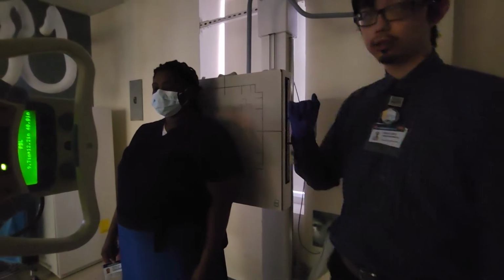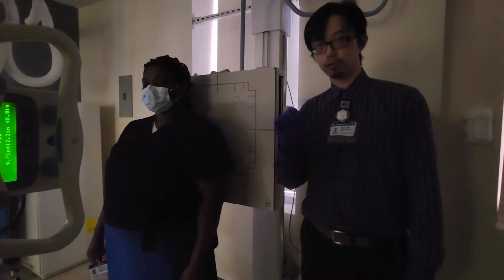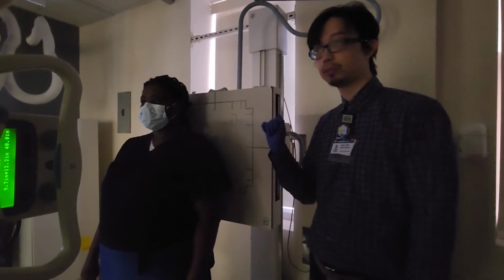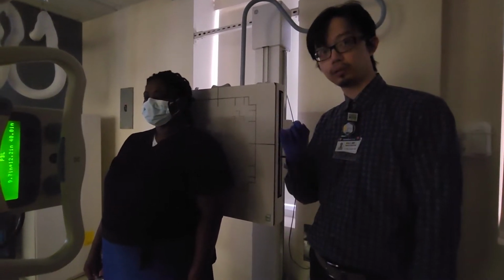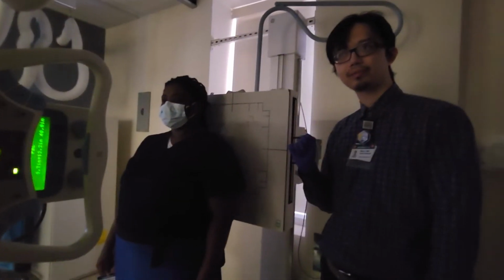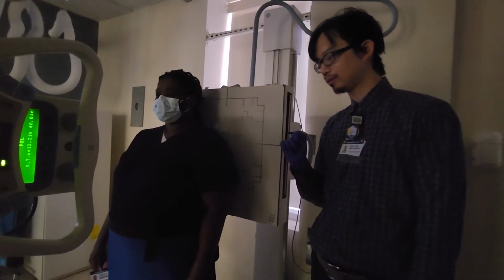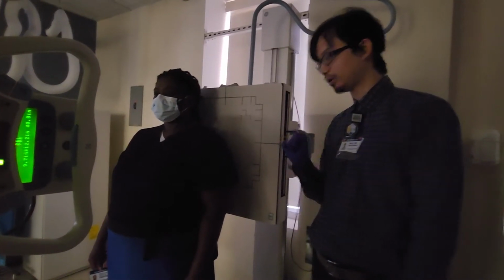What we normally want to do is an internal rotation shoulder and an external rotation shoulder. So let's talk about external rotation. Your external rotation shoulder is positioned the same way as your AP humerus. So what do we need to do with this arm? Turn it. You mean like with the elbow thing? Mm-hmm. Okay, so make sure the epicondyles are parallel. Parallel to the IR. IR, very good.